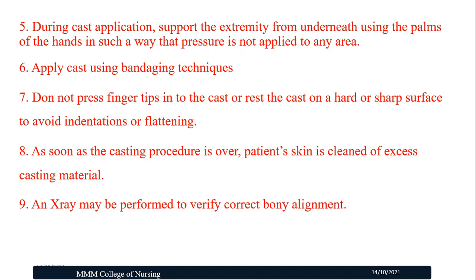Then apply the cast using bandaging techniques. Do not press fingertips into the cast or rest the cast on a hard surface or sharp area, to avoid indentations or flattening of the cast, which will give rise to skin breakdown or pressure over the area, leading to some complications. These complications we will look into at the end of this video.